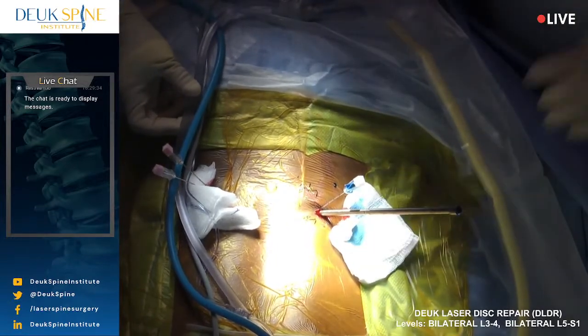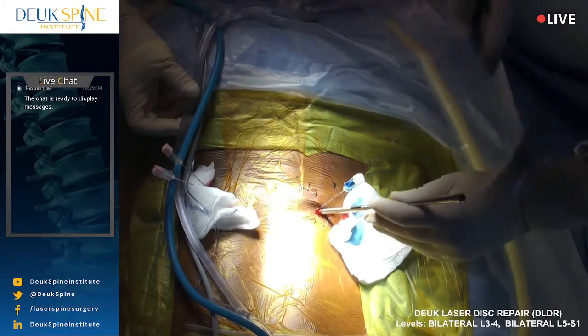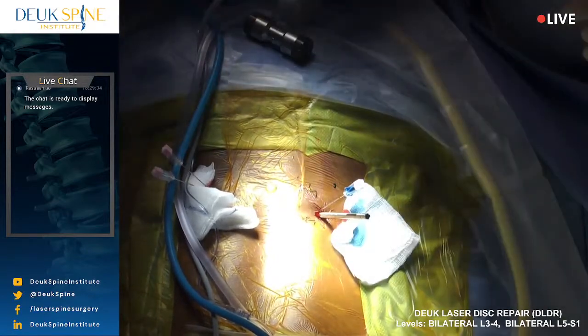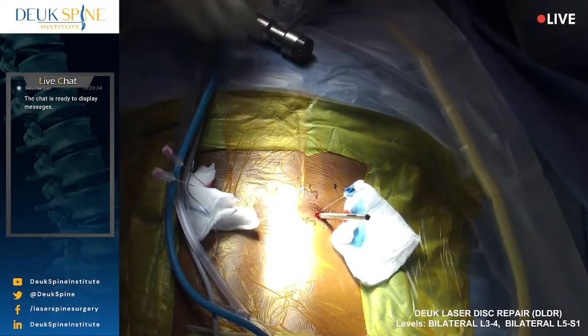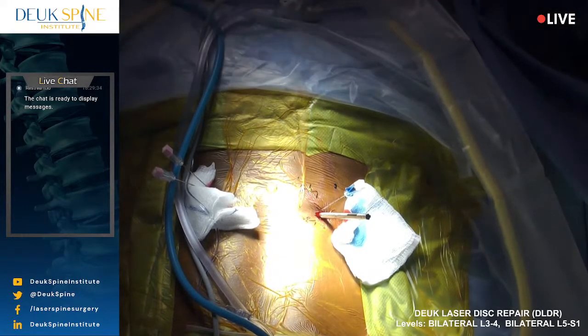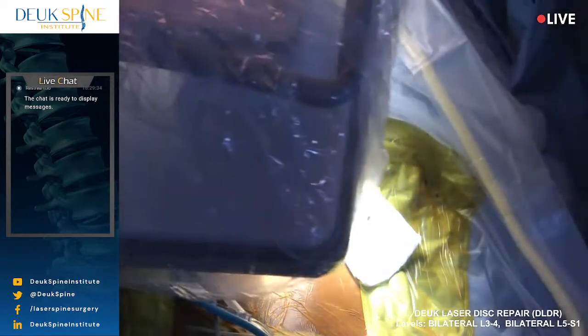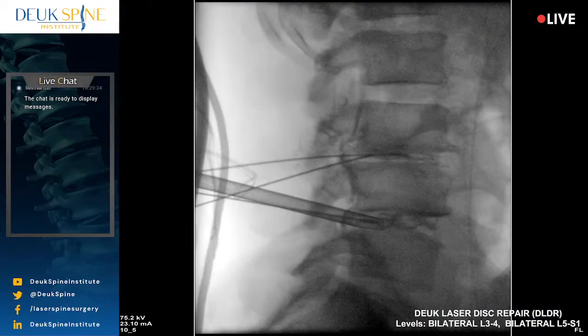Shot? Wonderful. Shot? All right. Laser? Wait, he took his evening dose at 3?